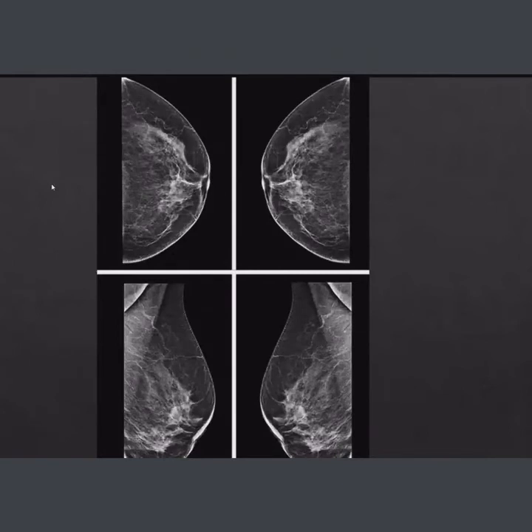Usually, worldwide, they do screening by mammography. They invite women for annual, sometimes biannual screening, which involves mammography. What is mammography? It is an X-ray of the breast.